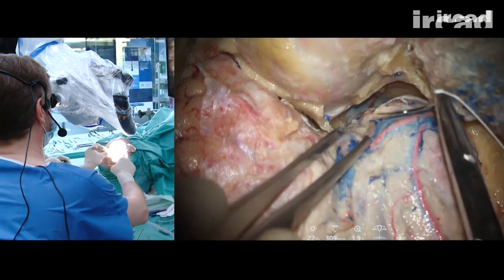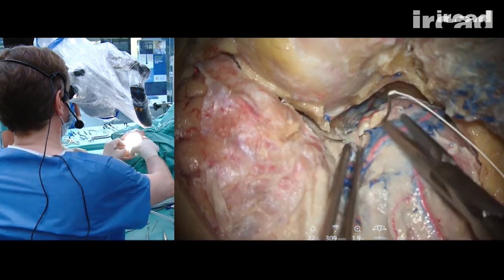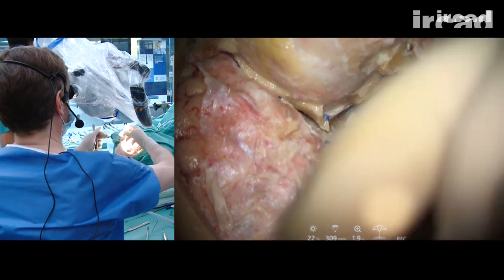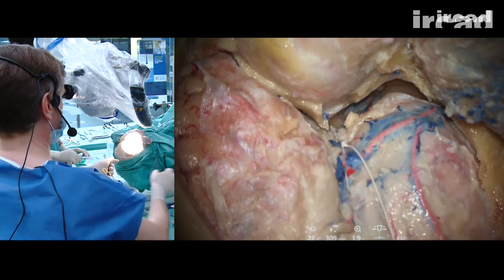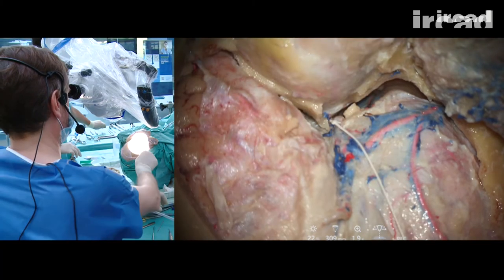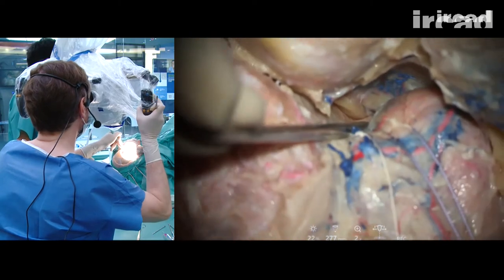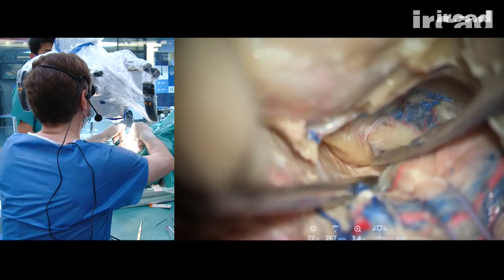Okay, let's try to retract the dura mater a little bit for the clinoidectomy. You need a little bit of retraction, not necessarily a lot, but you need a little bit of retraction. So the brain here is very stiff, so it is difficult to put a retractor.